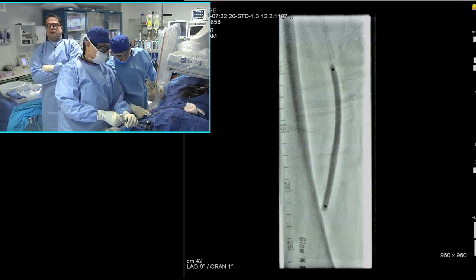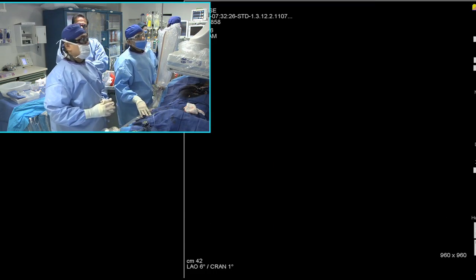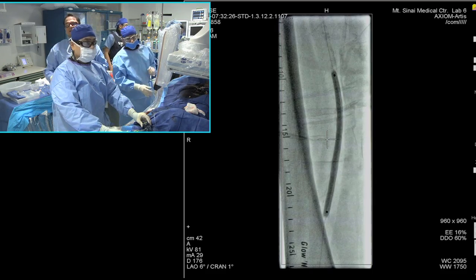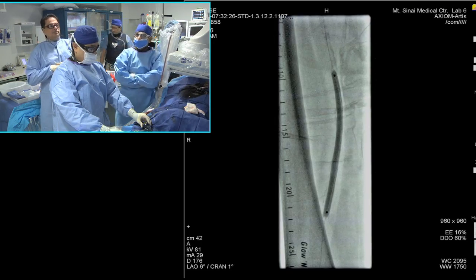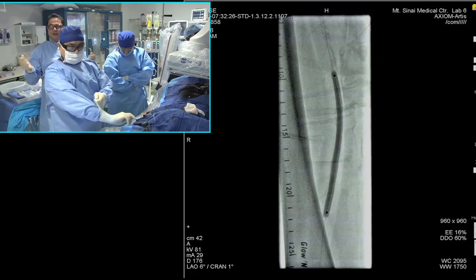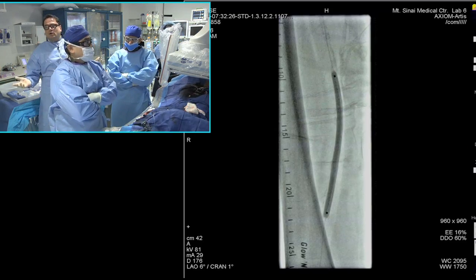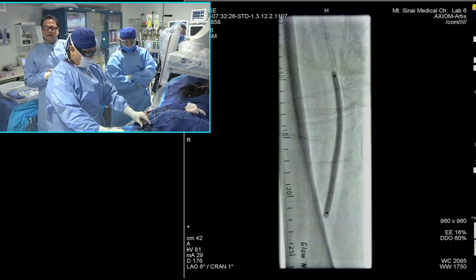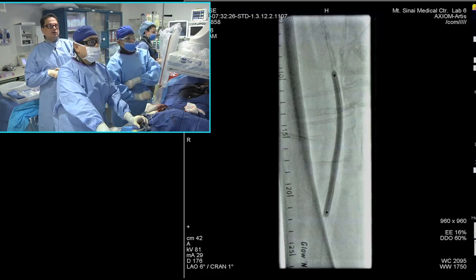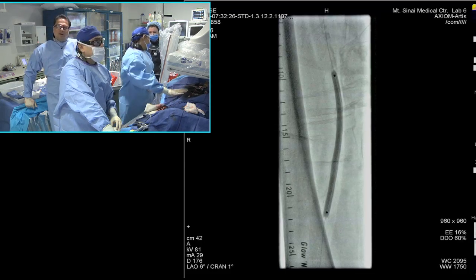trial. So the Imperial trial is actually the first trial in the peripheral space that I congratulate them wholeheartedly, because they've actually taken the premise that their stent, the Eluvia stent, which is not yet FDA approved, is better than the FDA approved Cook Zilver stent. But at least we're going to get an answer. Then you and I can now say, hey, this is not inferior, it's equal, there's no difference, Eluvia is better, or Zilver is better. So I think that's what's going to need to be done. Whether Medtronic or Lutonix chooses to do it, we don't know. But I think this is something that's going to need to be done either in a single center fashion or multi-center fashion, to really add to our data.